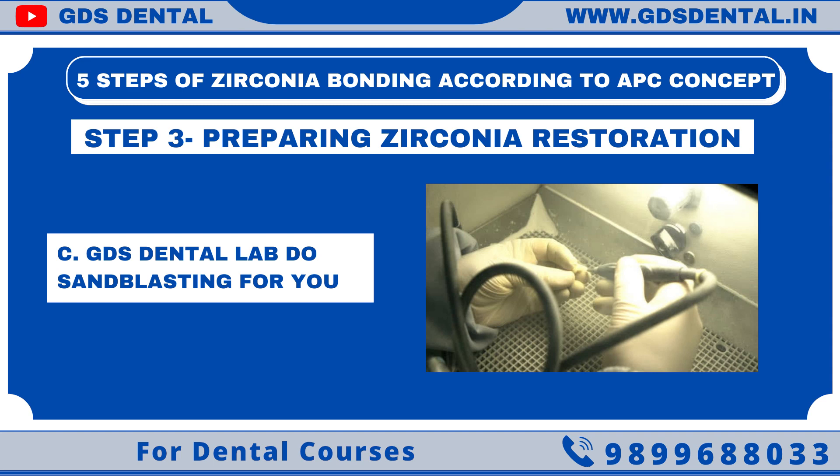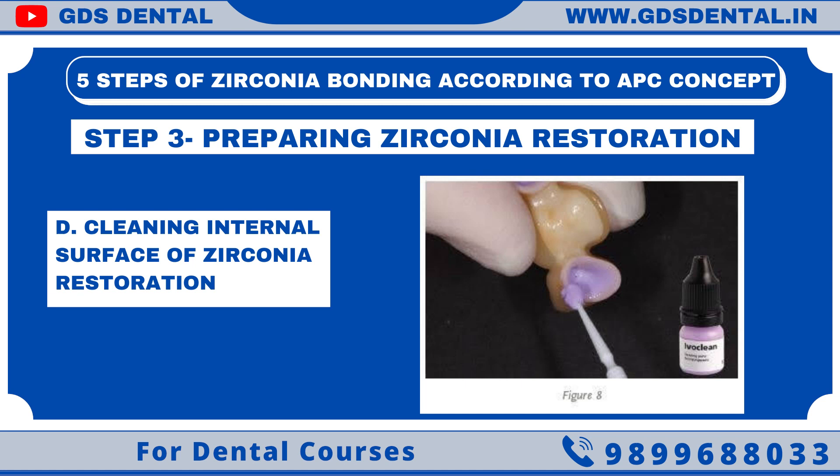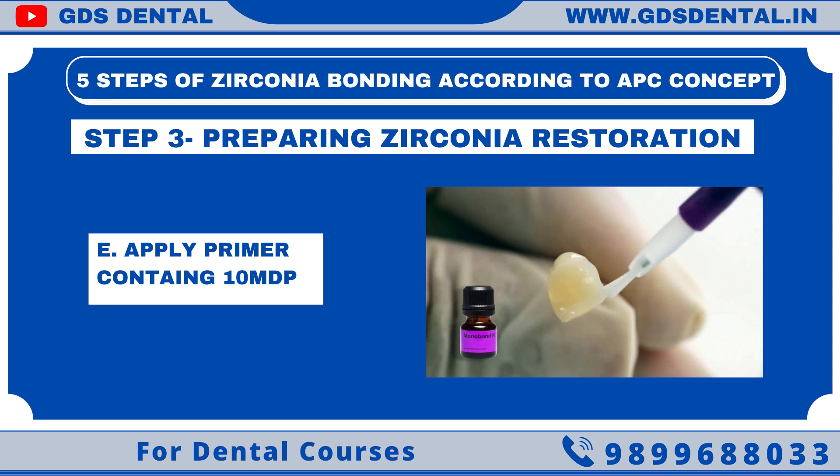After micro-etching, we have to clean the surface of the restoration. I like to use Ivoclean, because during try-in, salivary proteins bond to zirconia and can hamper bonding with the tooth. So Ivoclean is a must. Lastly, we have to apply metal primer, as it enhances bonding. If we use a metal primer which also contains 10 MDP, bonding will be even stronger. Hence I use Monobond N or Monobond Plus. Do not use Monobond HF Prime on zirconia.